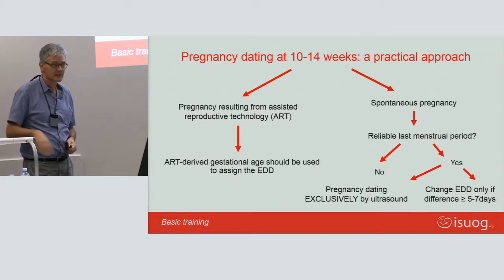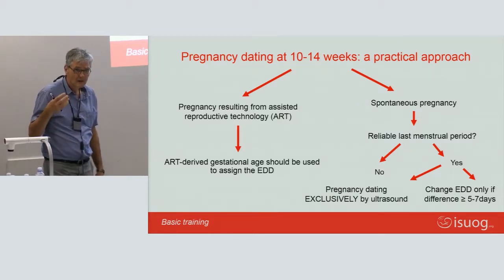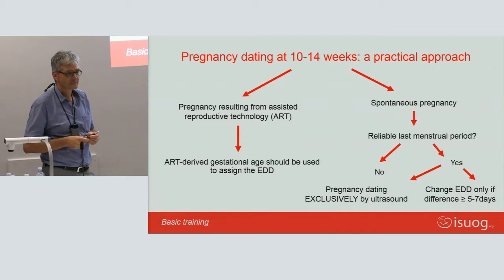There are other voices that say you just ignore this and go by the ultrasound only. Disadvantage of that: why don't we want to just ignore the menstrual history or ignore what the infertility guys say, because they confuse us anyway? What do we want to detect at 12, 14 weeks? That would be useful if there is really a discrepancy between our ultrasound dating and the clinical dating or historical dating.